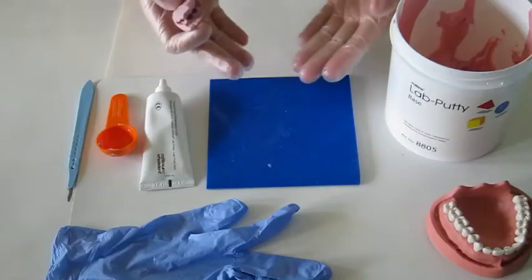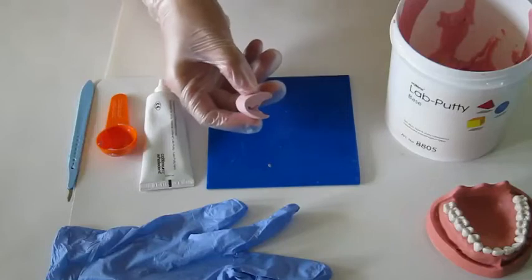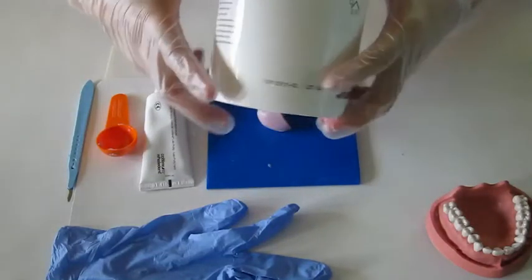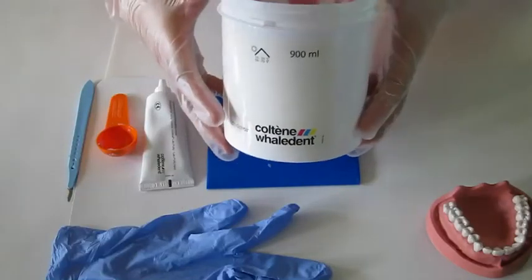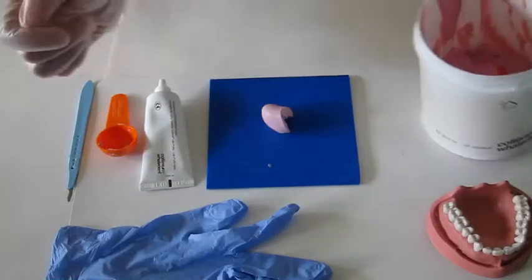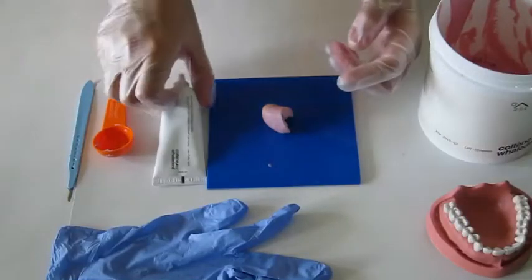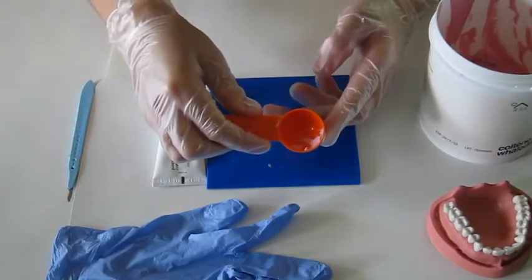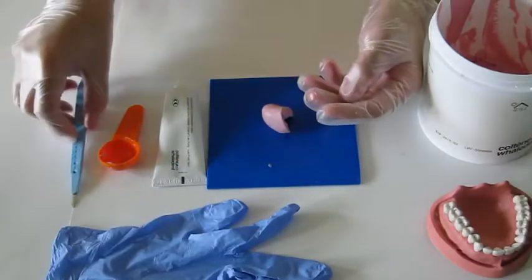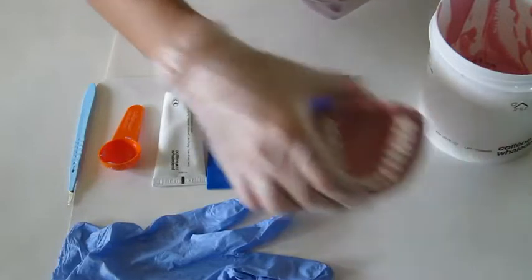Now you can see almost all the materials you will use today. Let me introduce them one by one. You will use lab putty, or you can call it base — this material is polyvinylsiloxane. You will use activator, a measuring scoop, a surgical blade, non-latex gloves, and this model.